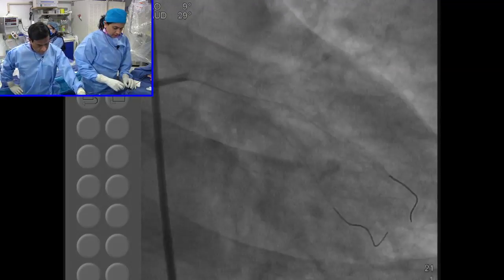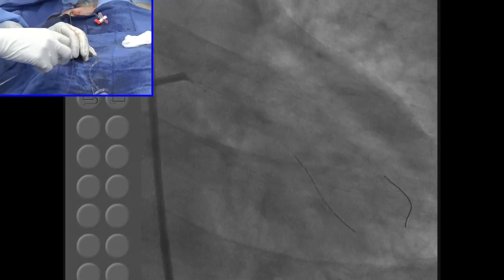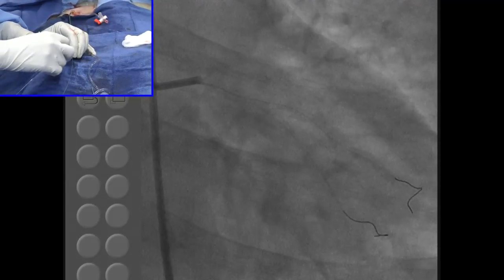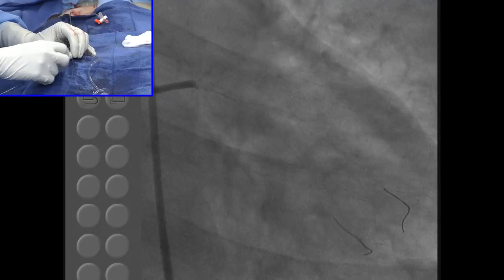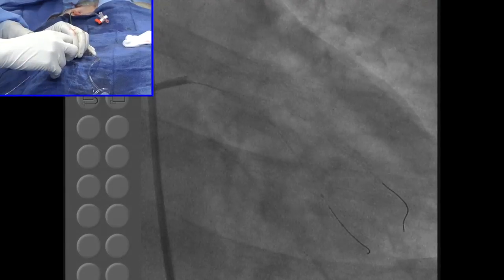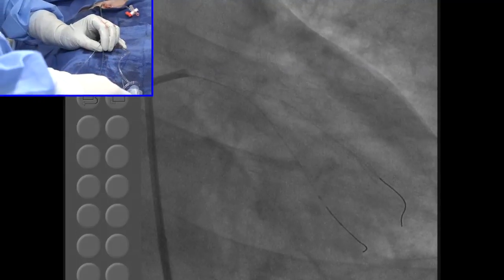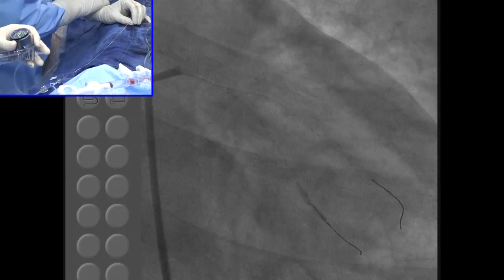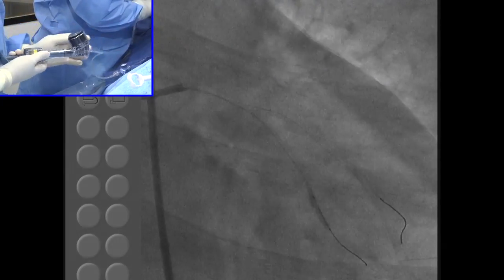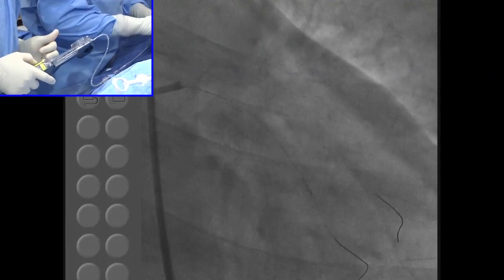Anu, anything different you do for bifurcation lesions so far as the anticoagulant or antiplatelet strategy? No, we still have Angiomax. ACT was 330 and the patient has been on Plavix. In this kind of case, using a 2B3A bolus in the end, if some area is only PTCA, will be okay. Because we know that 2B3A has shown consistently one thing, that they will decrease the side branch closure.